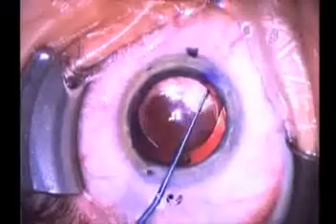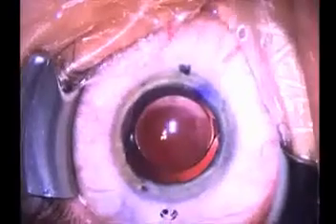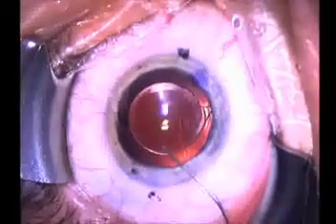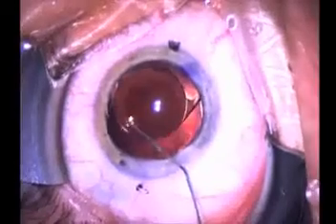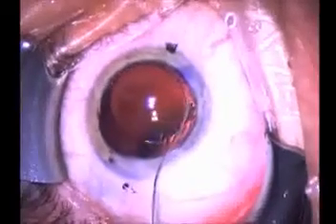If you look closely, you will see two sets of three little dots that are right at the edge of the lens in two locations. You will notice as we rotate and gently manipulate the lens inside the eye that those three dots are being rotated to correspond with the two marks that we placed on the cornea.